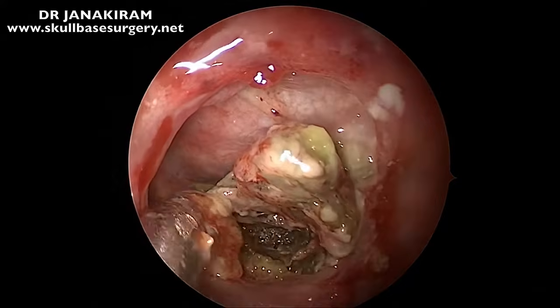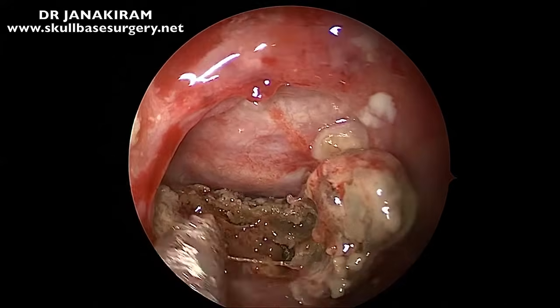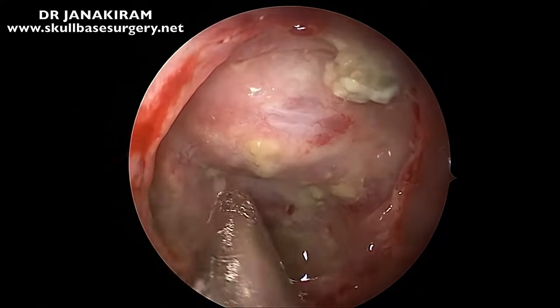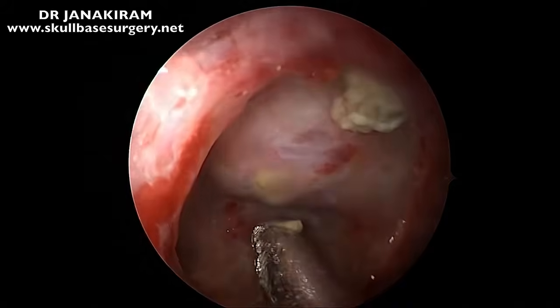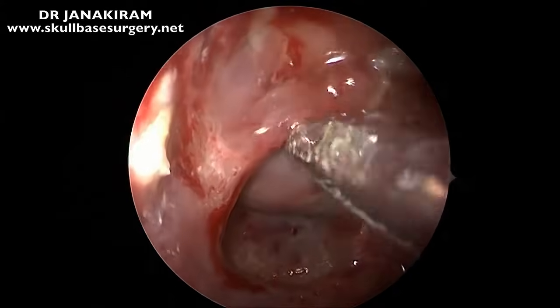The allergic mucin, the greenish material which is being sucked out there. Now we're giving irrigations with warm saline. So this video is primarily to show the anatomy of the structures related to the sphenoid sinus.